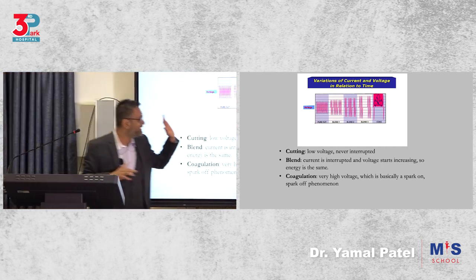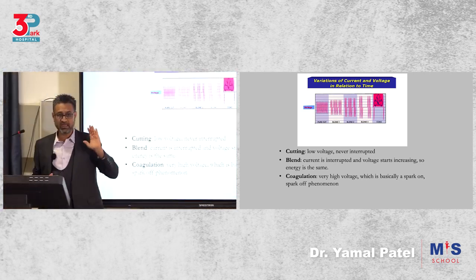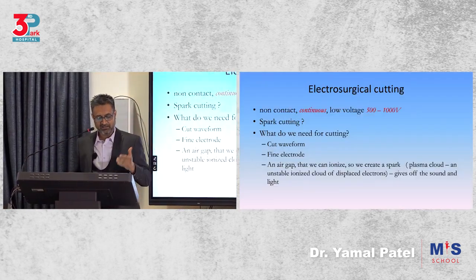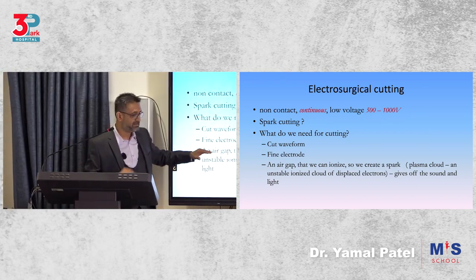So you don't go there if you don't have to. You stick to these sides more, okay? So this is about energy. Cutting should be non-contact, continuous, and what we need for cutting is a cut waveform, fine electrode and an air gap.